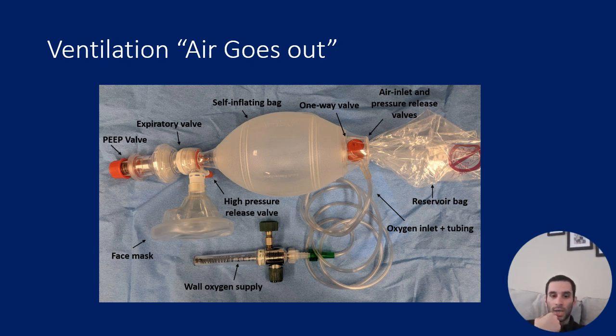So this is your standard bag valve mask. I think all of you have seen some version of this. Note this one has a PEEP valve on it, and that's really important to help you oxygenate the patient even further. So I recommend if you don't have a PEEP valve, you should get one. We'll talk more about what PEEP is a little bit later.